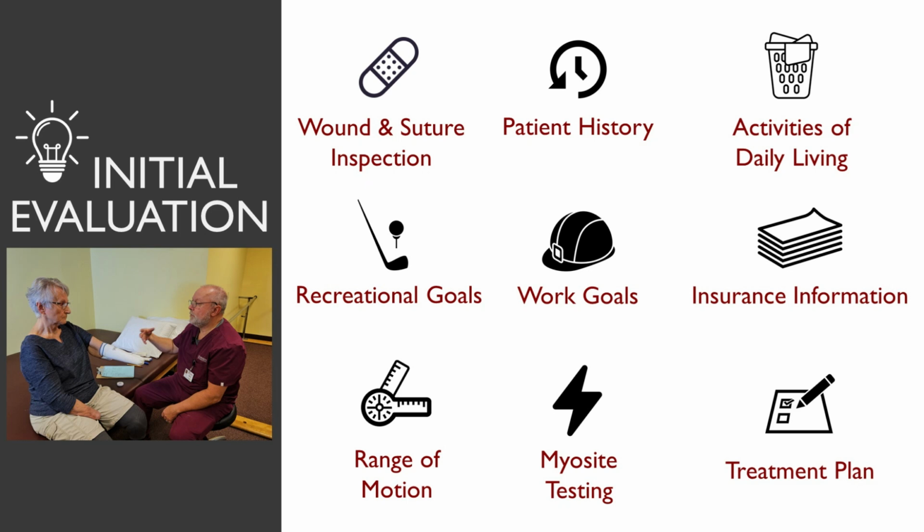And obviously throughout this process, we're working very closely with the team. And I think that's one thing that makes us, and Mike as the upper extremity specialist, a little bit more unique in how we approach the care for these patients. So he's going to work alongside OTs and utilize the information they've already gathered and worked on throughout therapy, and what the range of motion looks like for this patient, to make sure that we're fitting them with what's going to work best and what the goals for this patient are as well. So at the end of this evaluation, we're not only determining what device best fits the patient, but also we're going to start putting things together that we're going to be working on in the background, such as our documentation, working alongside the doctors and the therapist on gathering those clinical notes, putting together the treatment codes that we know we have to submit to the insurance to get the authorization so that we can get this device approved and begin the actual fitting process and providing the device to somebody.